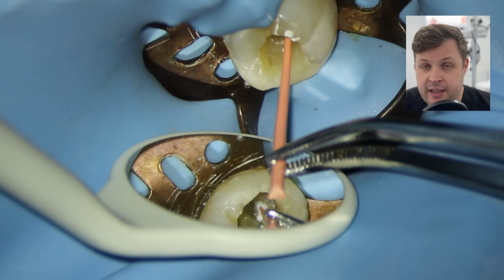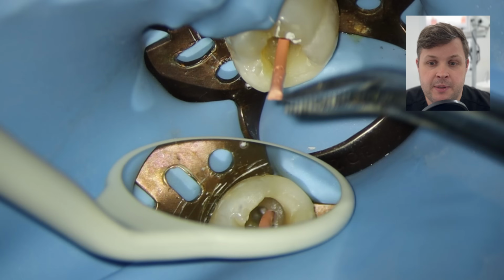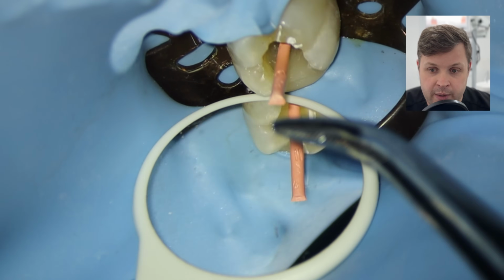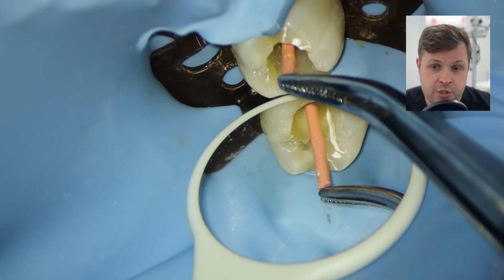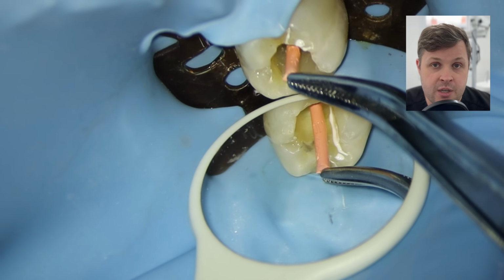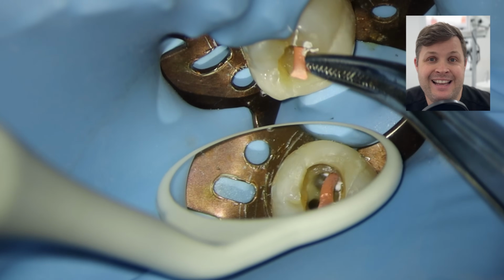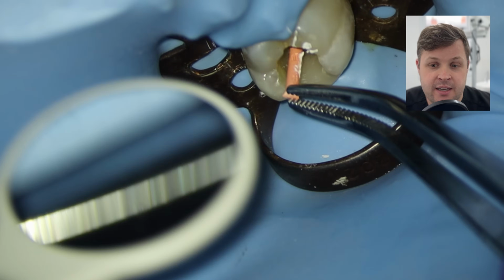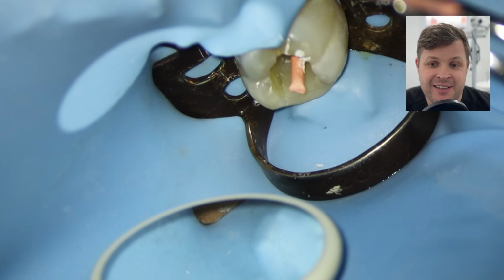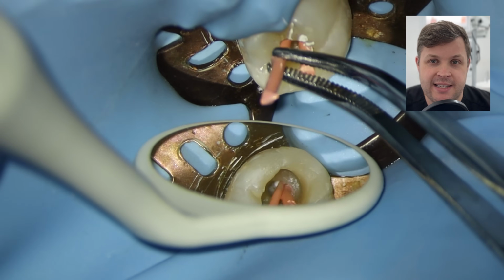And again, like I've mentioned before, we're just going to very gently tap this GP cone to length. We're not going to ram it all the way home. Don't want to risk extrusion. We're just going to push it really nicely to length. And because the distal canal is quite wide, I'm going to place a second GP point adjacent to this master cone, just so we make sure that we have this canal all nice and filled up.